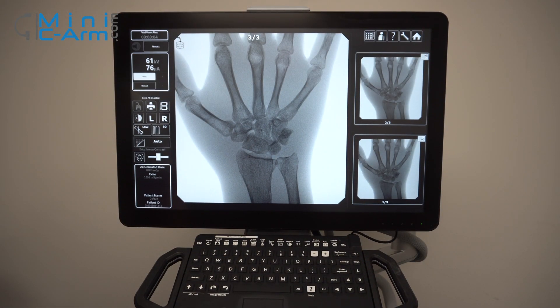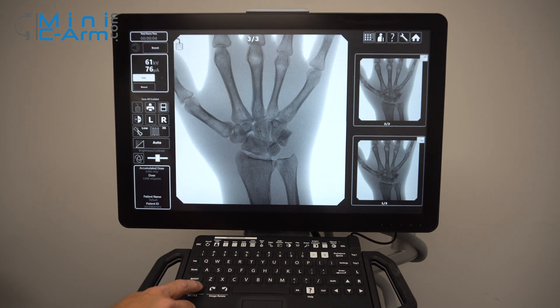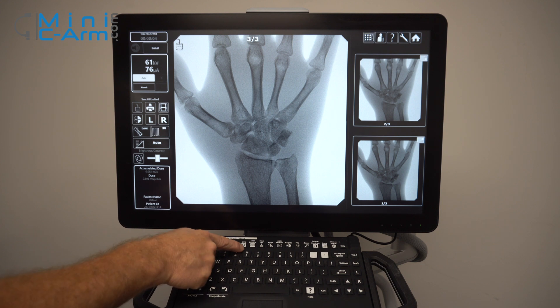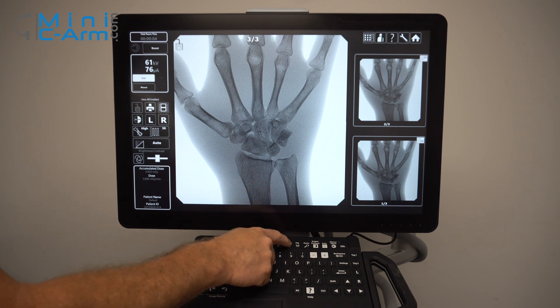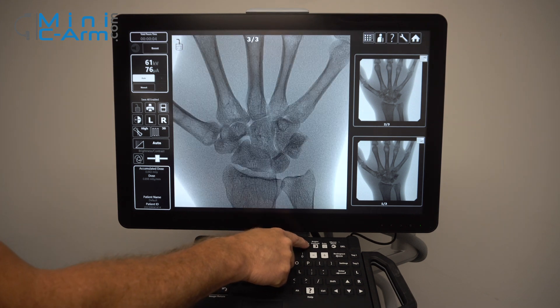Here are your keyboard functions for the OrthoScan FD Pulse. You can rotate your image clockwise or counter-clockwise. You can change your technique up and down manually. Hit your recall button, your patient information. You can save and print. Here's your cine loop, your case review, and save all function. This changes your edge. Your still motion, which is your noise reduction. Your negate. You can flip your image and you can zoom your image in.